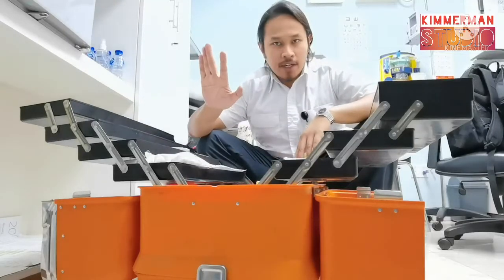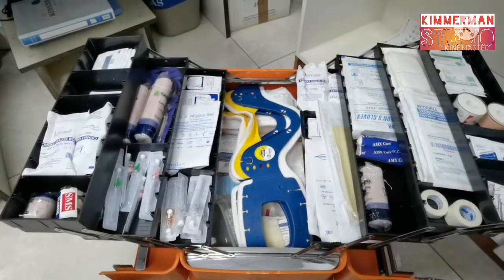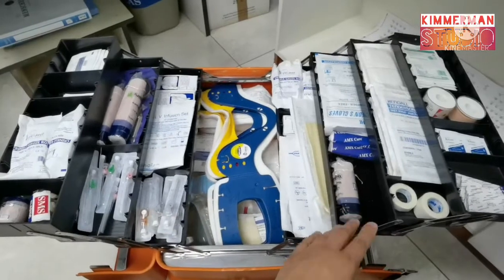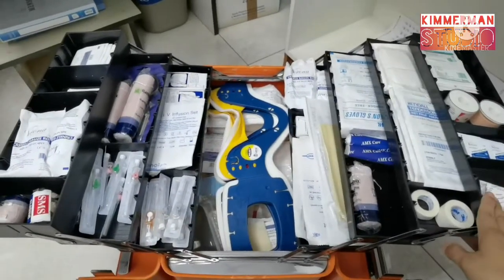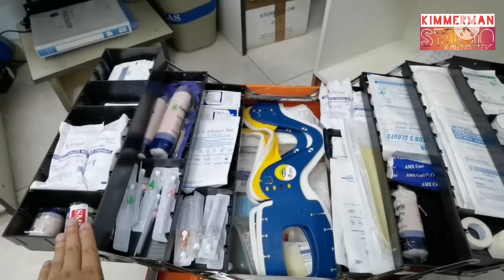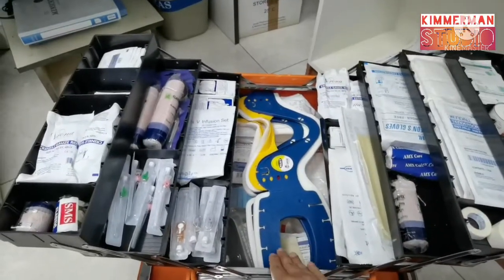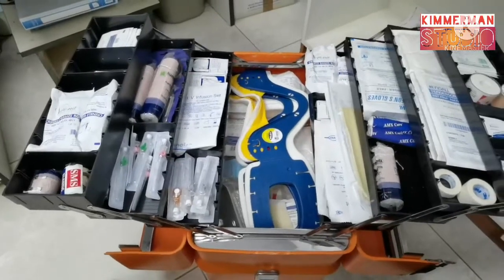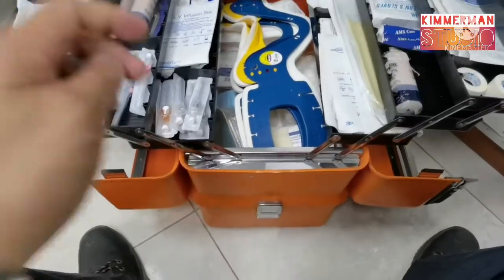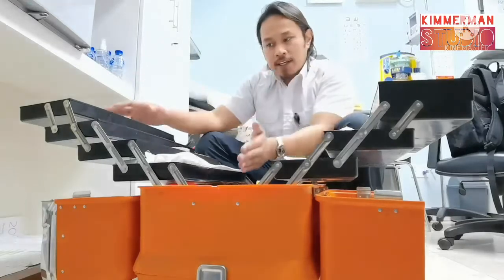Facing the box, this is my right side, this is my left side. You will notice as I open this box that the left side has 3 shelves and the right side has 4 shelves. Shelf 1, 2, 3, 4 for the right side, and shelf 1, 2, 3 on the left side, and this composes the upper compartment. Below this is the lower compartment, which we will open later. So we start on the left side because it has 3 shelves.